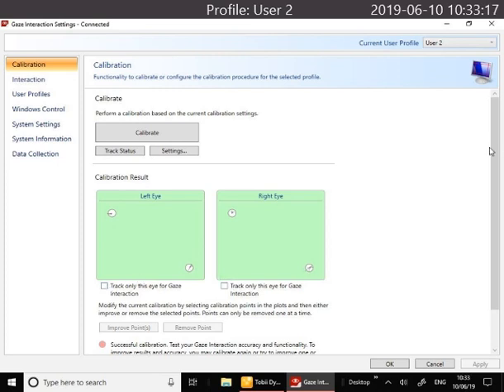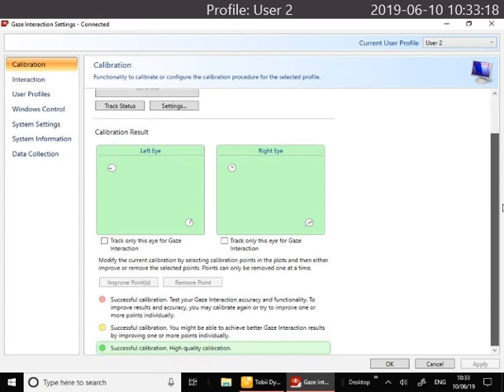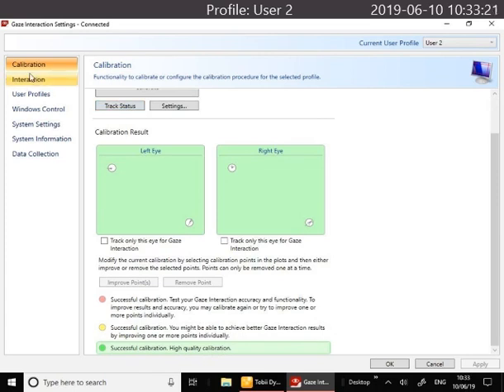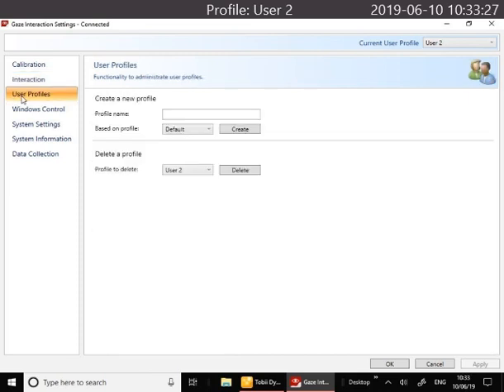Once you've done this, just down the side here, Interaction. This is how you can change dwell times and things. You can have different user profiles if you've got multiple users using the system.